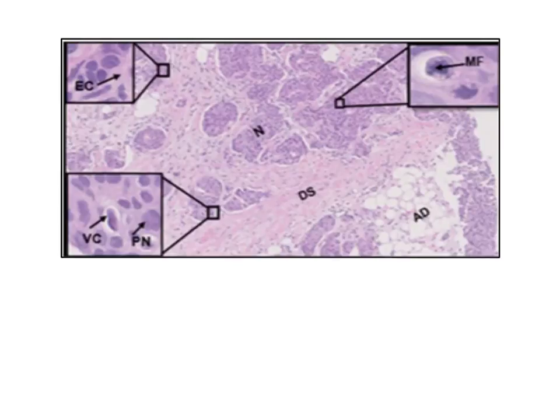Furthermore, malignant cells have been observed in Figure 1 as they ideally form the hallmark solid nests, N, architecture and ductal structures. Using myoepithelial biomarkers promotes the ability to differentiate between invasive carcinoma and benign proliferation, which have similar morphological features. Thus, the keratins CK5 and CK14, having high molecular weight, can distinguish between ductal hyperplasia and low-grade ductal carcinoma in situ. Once some myoepithelial layer has been breached in the basement membrane, the high abundance and antigenic nature of keratins are seen.